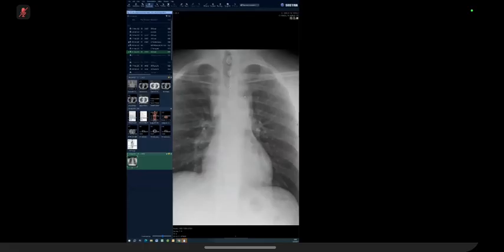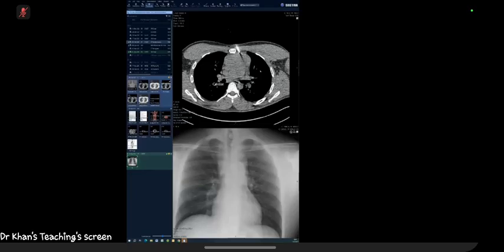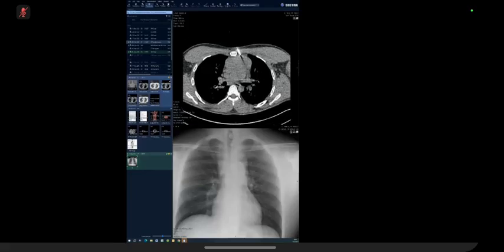But this one, you said widening of the superior mediastinum. You did not say it was smooth contours. You did not say it extended up into the cervix or the cervical region or not. You did not offer the silhouette sign. You didn't talk about the aorta till the end. But you got it right, but you didn't maximize your marks for some reason, even though the knowledge was all there. When you've picked a superior mediastinal mass, you have to say all the terrible T's.